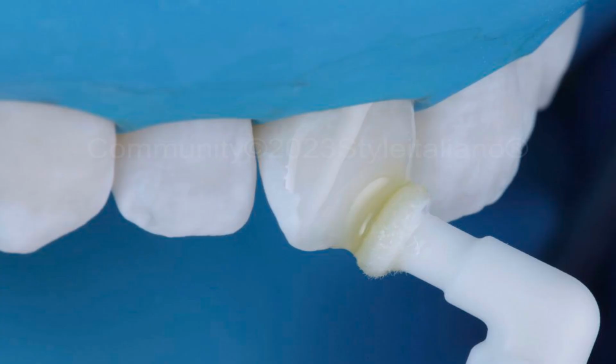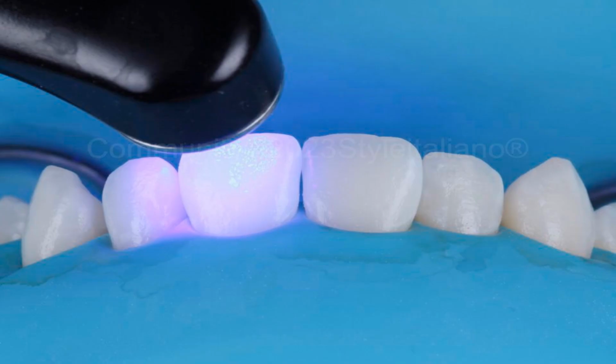Resin infiltration step: application of triethylene glycol dimethacrylate resin for 1 minute with a scrubbing motion, followed by a period of 2 minutes to allow the resin to penetrate into the exposed enamel prisms. Excess resin is blotted dry. All of the contact points are flossed and, critically, each tooth is lightly cured perpendicularly to the surface for 40 seconds, not 20 seconds like composite, but 40 seconds.